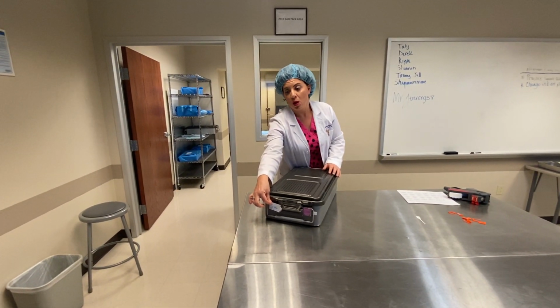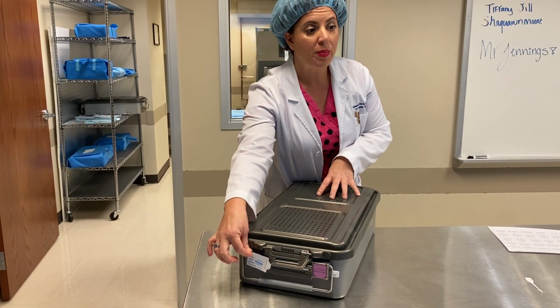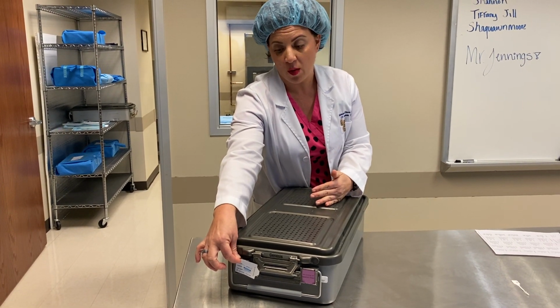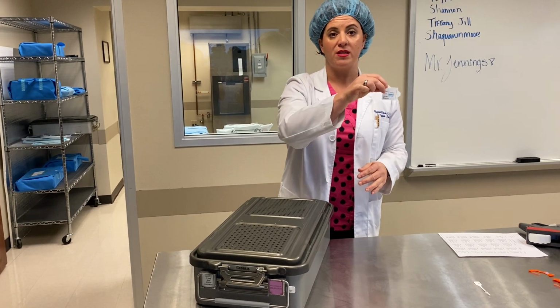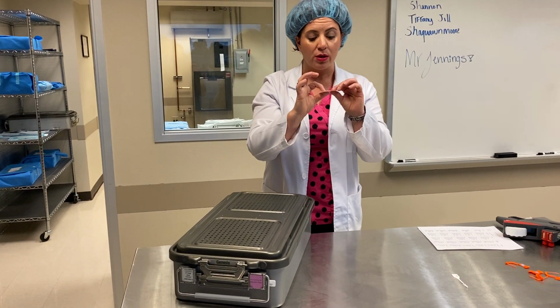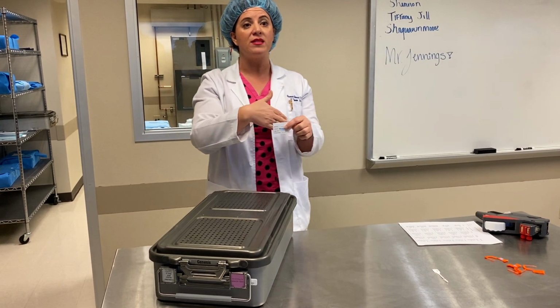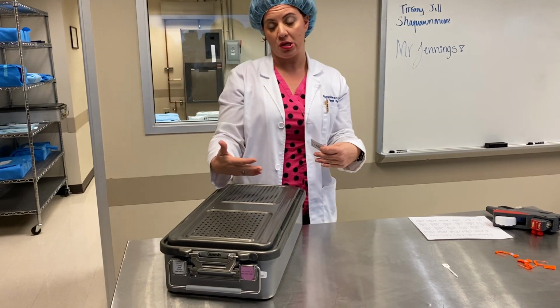All right, so say that there is an issue with this tray. Say you open it up in the operating room and it's wet underneath inside the tray. This is gonna be something important that you take back to sterile processing so that they can look and see, oh, what sterilizer was it run in? Maybe we should check that sterilizer and see if it's working properly or if it's malfunctioning.